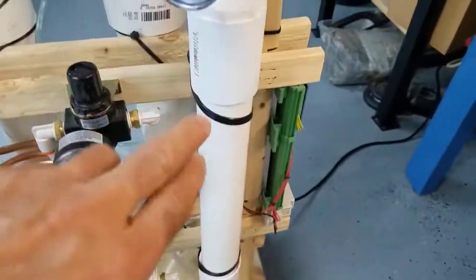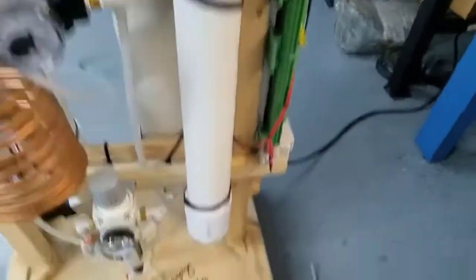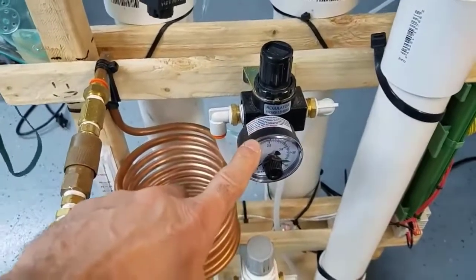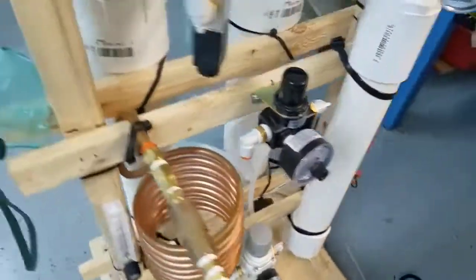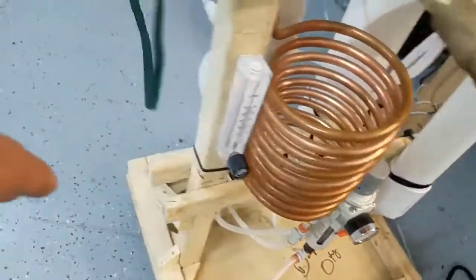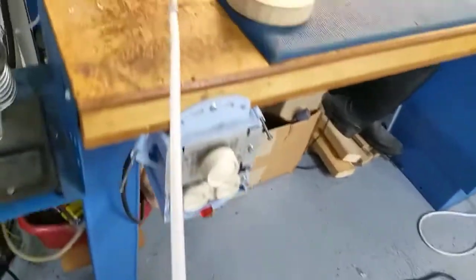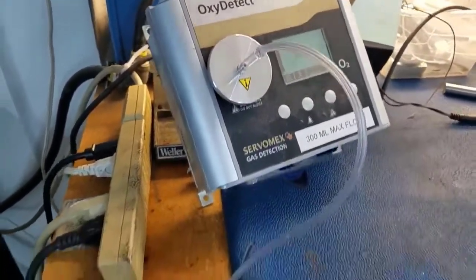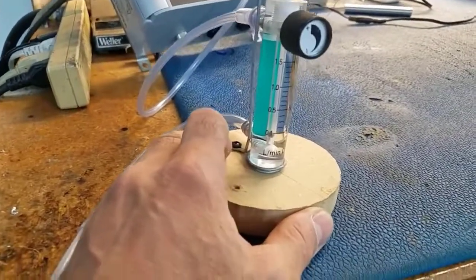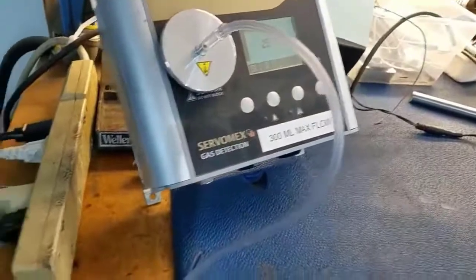The output goes into a surge tank — basically an empty canister that temporarily holds the oxygen before it's consumed. The output of the surge tank goes into the second pressure regulator, a low-pressure regulator set at around seven or eight PSI. The output from this regulator then goes into our output flow meter, which is set to 15 LPM. The output from the flow meter is split: one side goes into our mask, the other side goes into our oxygen sensor — our oxygen meter — which tells us if it's actually making oxygen. That sensor flow meter is set to about 300 milliliters per minute, as the label reads 300 milliliters maximum.